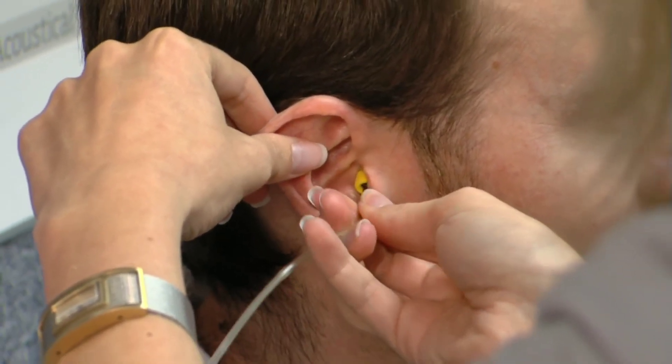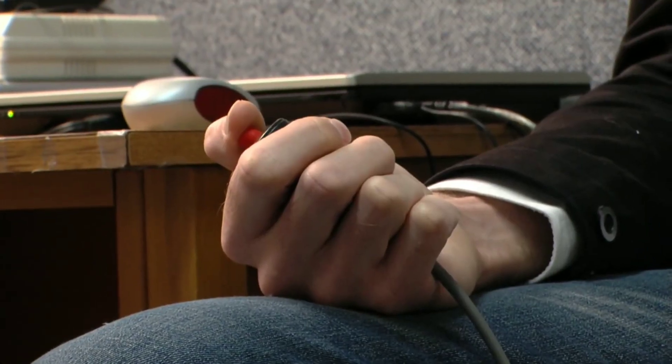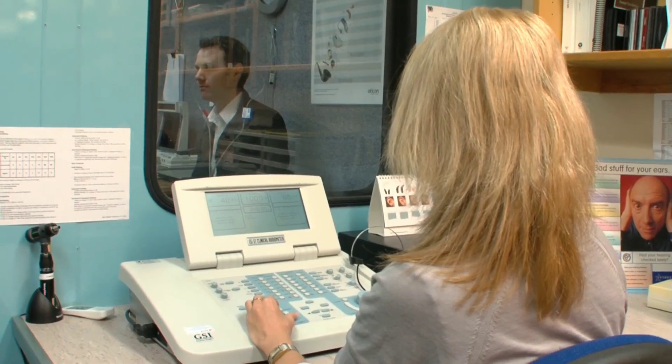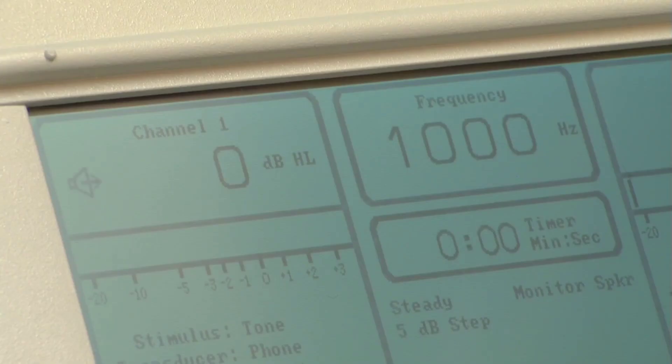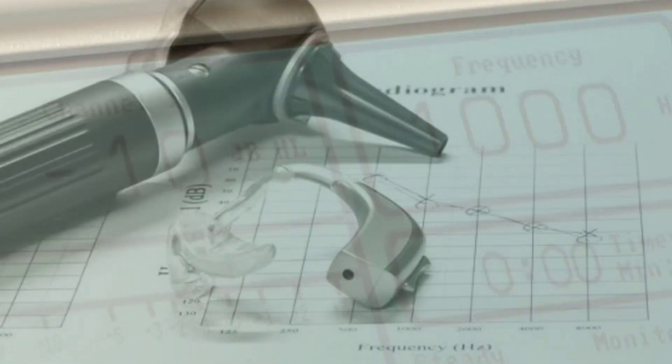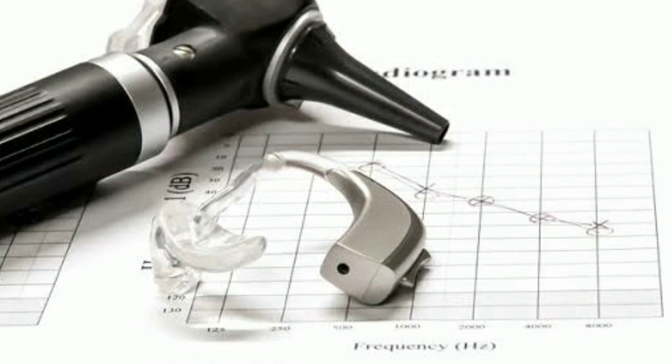Let's begin. Your audiologist will begin your hearing test by presenting tones of varying frequencies and loudness through insert earphones. While you are pressing a button to signal which tones you can hear, she will be marking the softest sounds heard on a graph that's called an audiogram.